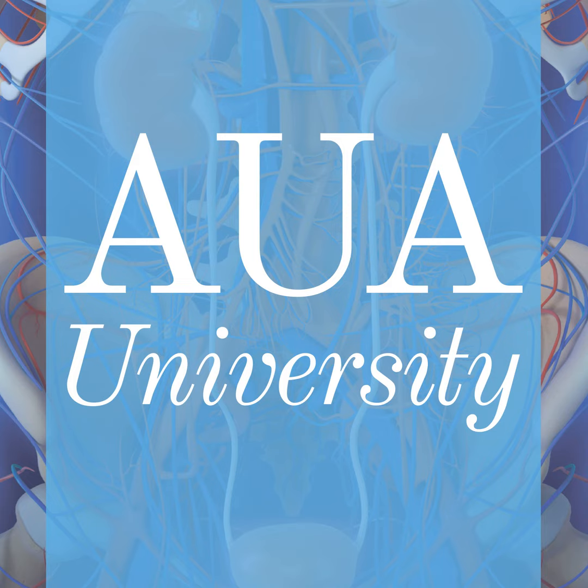They found that the 2 most important characteristics were pathologic grade and disease burden in the prostate biopsy. From that, they developed this tool to predict the probability of upstaging. It gives a nice summary of when potentially you should use PSMA PET if you're not sure.